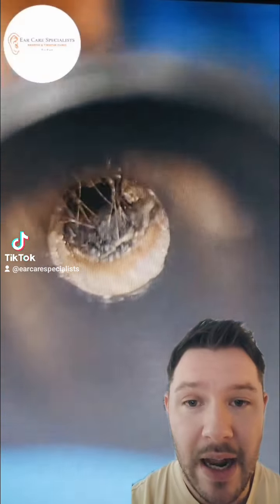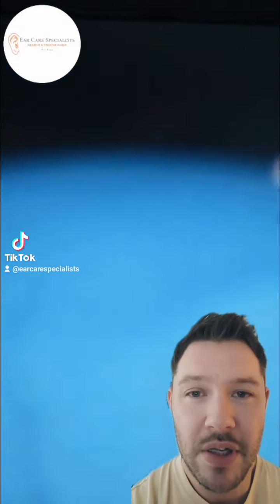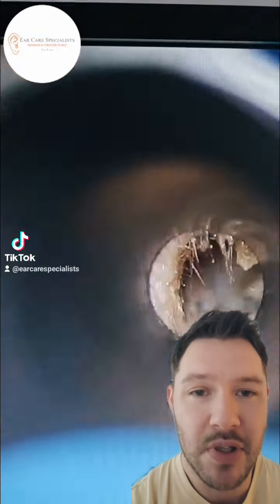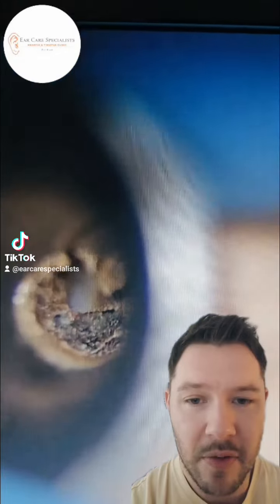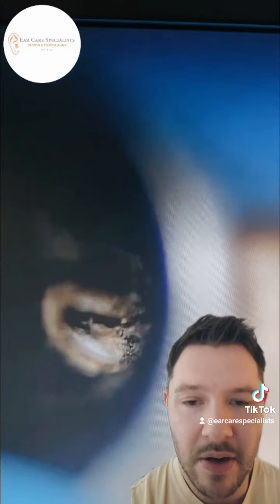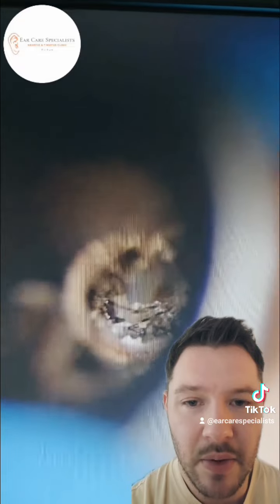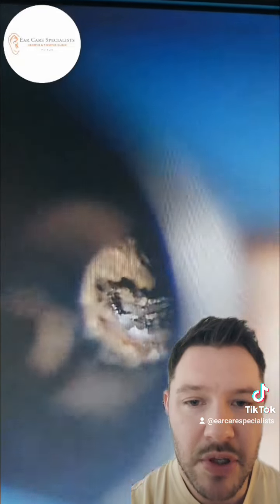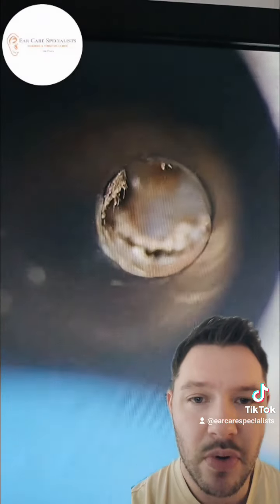As we go back in and have a look, you'll notice on the floor of the canal there's still this ridge of wax and some skin debris. We're going to try and get that in a second, but you have to be a little bit careful because it can stay stuck to the canal, and when you lift that up it can be a bit tender underneath. So you have to be mindful of that — if it looks like it's wiggling and wants to move, then great, we pursue it. If it doesn't, then you might advise more oil drops.